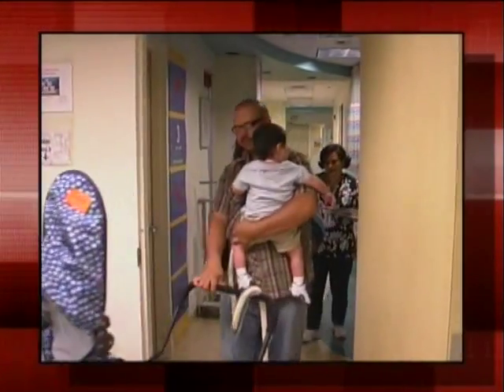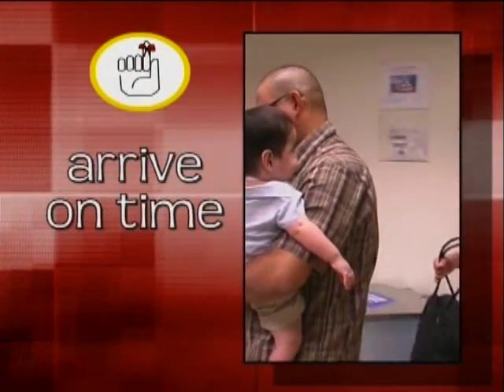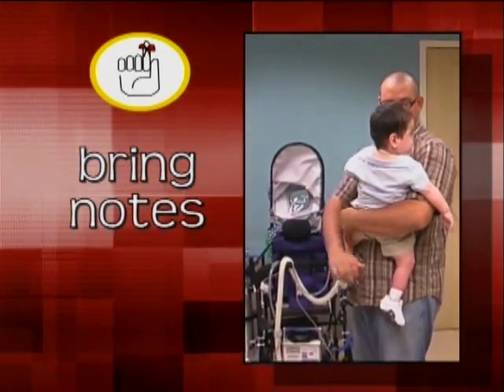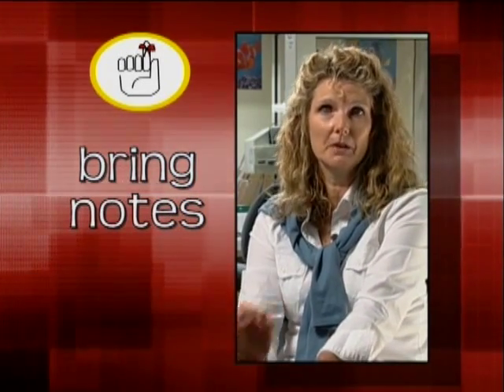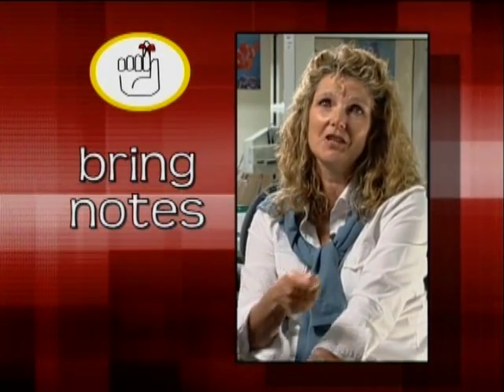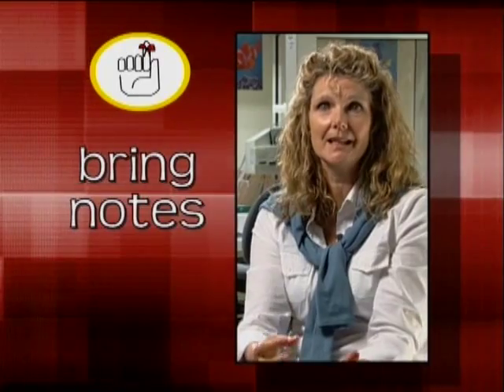Whenever I make an appointment, I try to be here on time. I bring all my notes. If Jonathan's having any problems, I let him know. We have a flow sheet of information on how his ventilator is working. Every night we record some details. So when I come in for an appointment, I just grab that sheet and show the doctor. He's got what he needs.